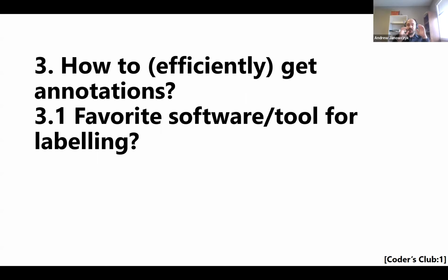And the benefit of that is that once the student's actually able to do it, it speaks to Geert's point. We're not wasting the pathologist's time to go and click on these individual cells or whatever it is. But then they start to have better technical ideas of how to use available technology to address the problem because they're more experienced in that domain space.